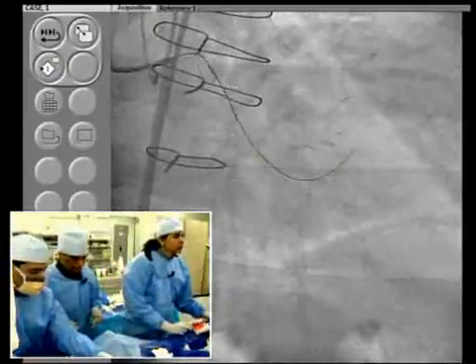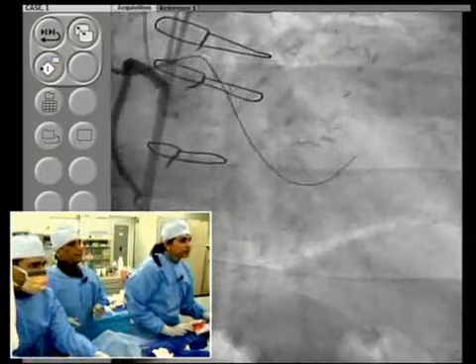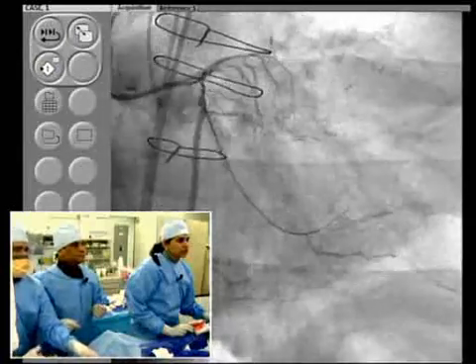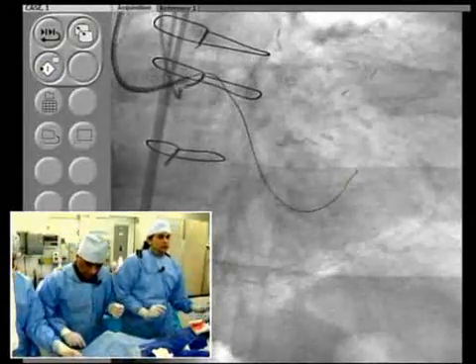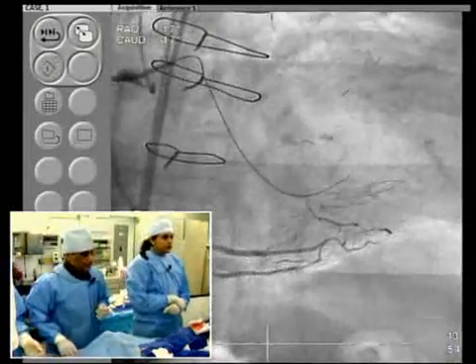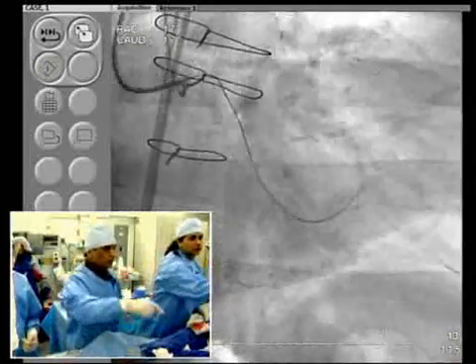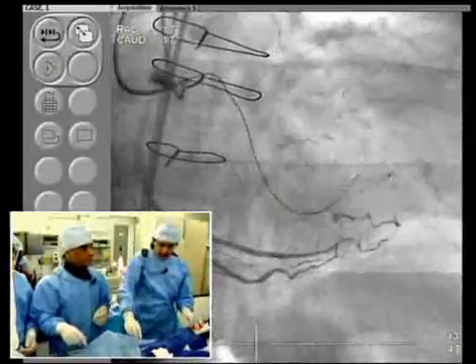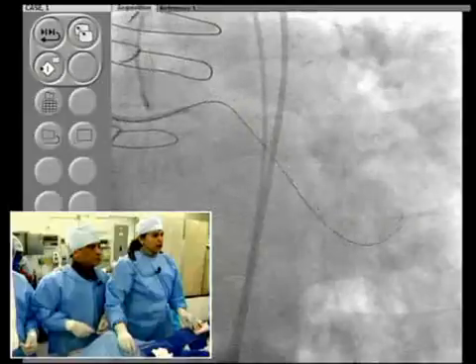Now you want to take a picture? That looks more promising there. The wire we'll not see tracked, but yeah. Hard to tell, not sure. No, there's no branch. Okay, for the sake of time, the very simple thing we should do now is take care of the circumflex before the bifurcation. You are in the lumen? Then you want to pull back and try to go to the lower one. No, we should not. That's what killed us earlier. Let's just do the upper one and be happy.